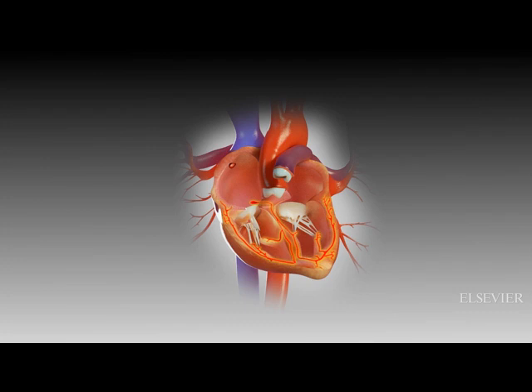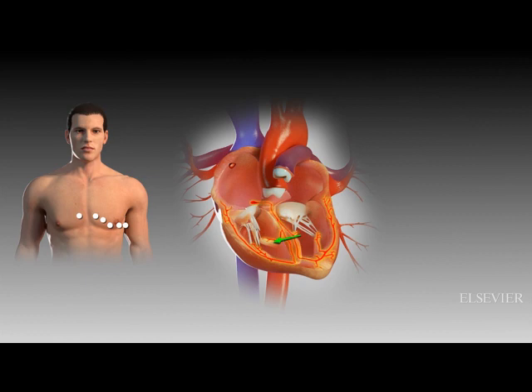Normally, the first part of the ventricles to be depolarized is the left side of the interventricular septum. On the normal ECG, this septal depolarization produces a small septal R wave in lead V1 and a small septal Q wave in lead V6. Because the left side of the septum is stimulated by a branch of the left bundle, a right bundle branch block will not affect septal depolarization.